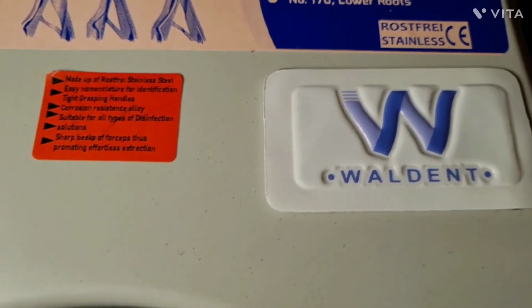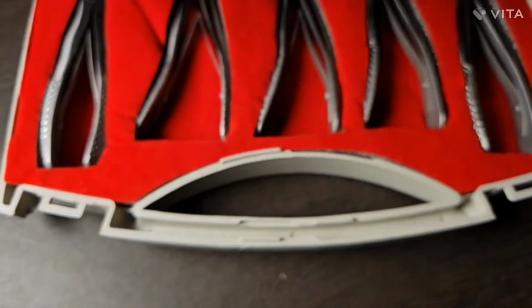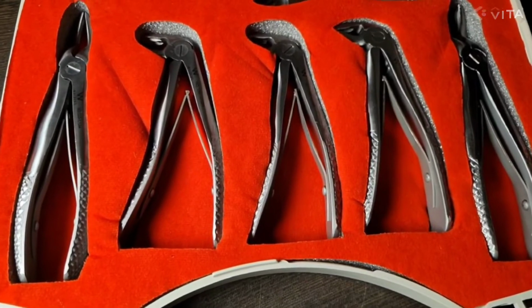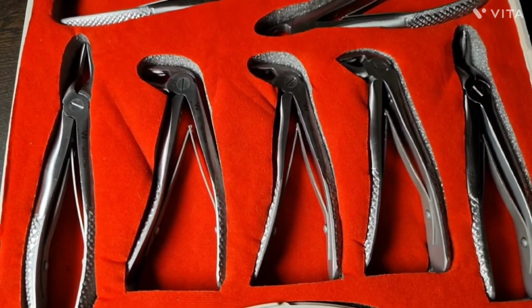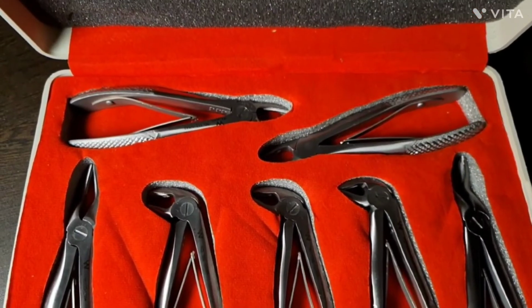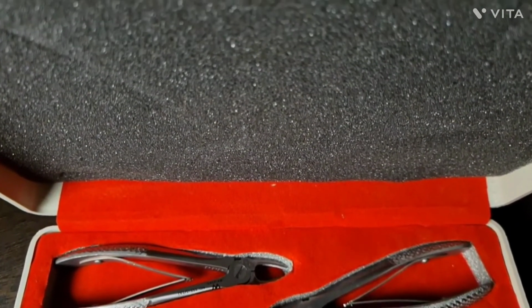This video is a demonstration of pedo extraction forceps, how we are going to do the extraction in a child patient. So for the demonstration, we are using a budget-friendly pedo extraction kit of Waldent. I received the kit the next day of placing the order and I bought it from Dental Cart, so fast delivery. It comes with 7 extraction forceps that are required for extraction in a child patient.